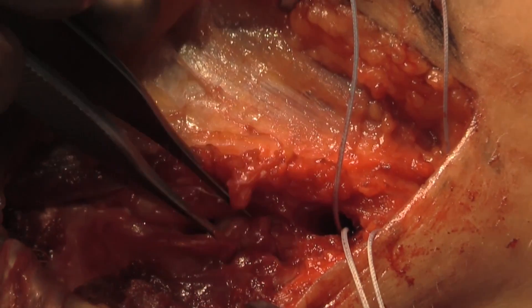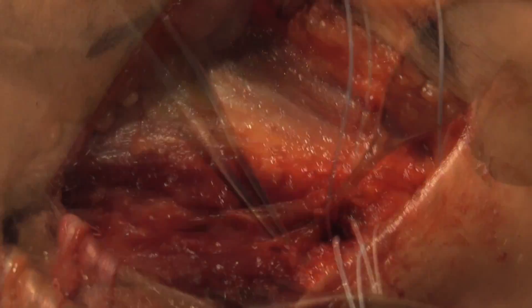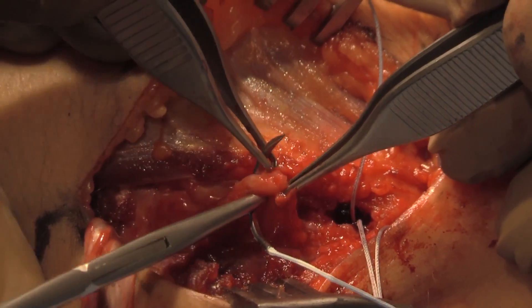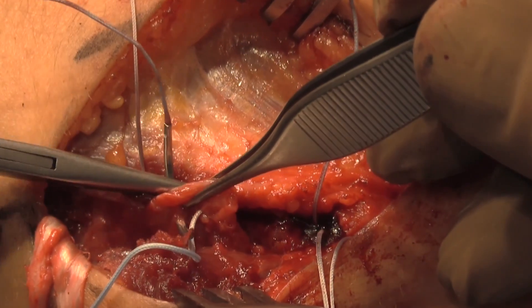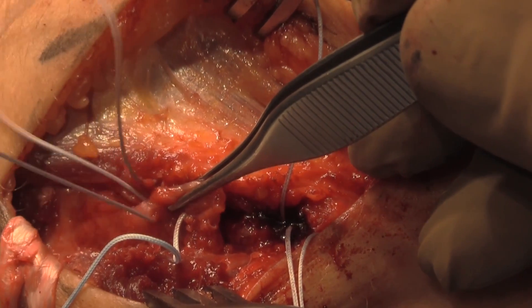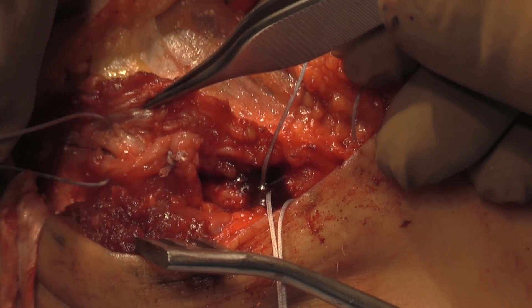At this point, the capsule is then imbricated with number two fiber wire. This is done with the arm at 60 degrees of flexion, with a valgus force, and with the arm pronated to allow imbrication of the capsule at this level.